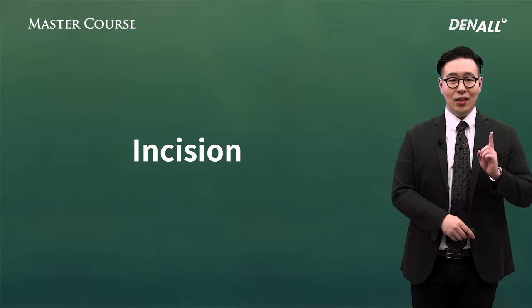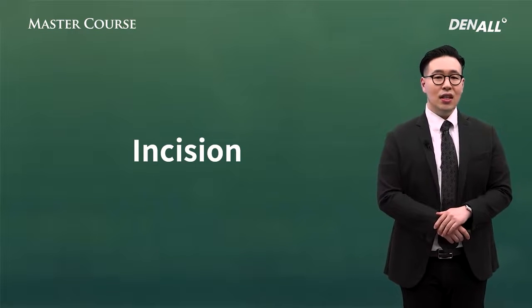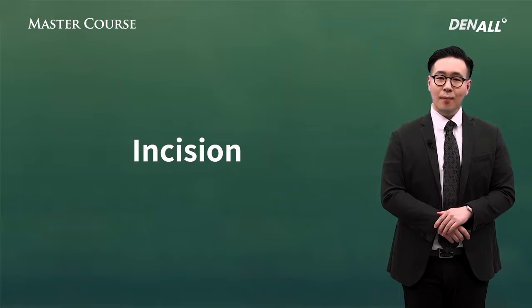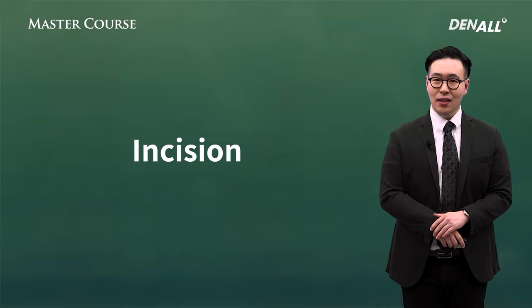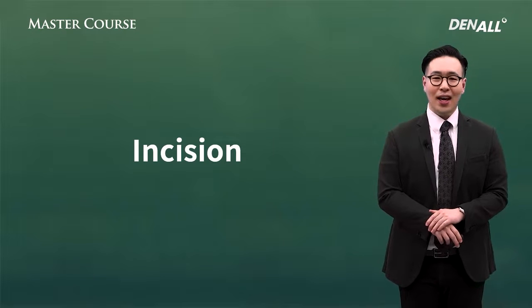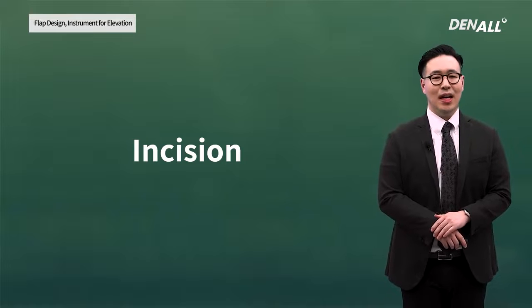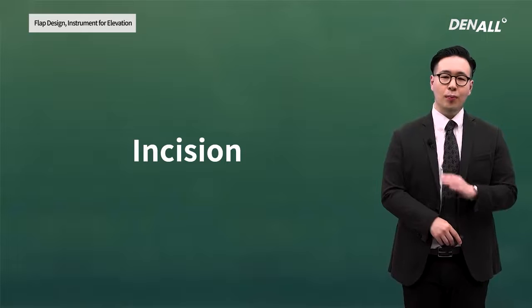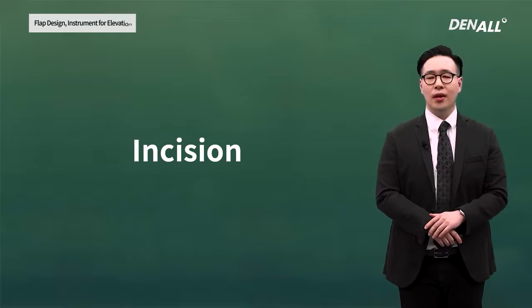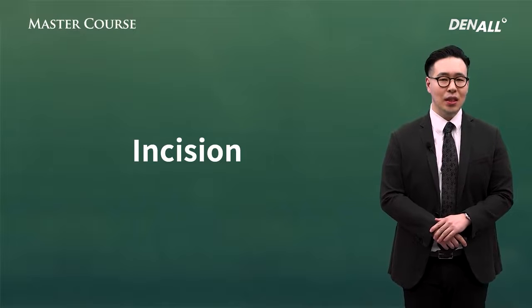Let me tell you an interesting saying related to surgery. A deft surgeon does incision slowly and really quickly does flap elevation, and a beginner does incision really fast and slowly elevates the flap. If accurate periosteum cut is complete in an ideal flap design, flap elevation is automatically done.